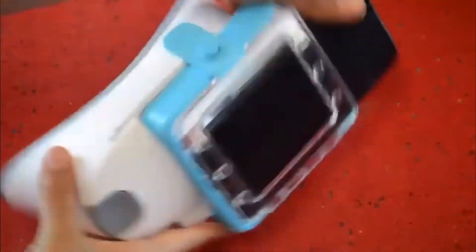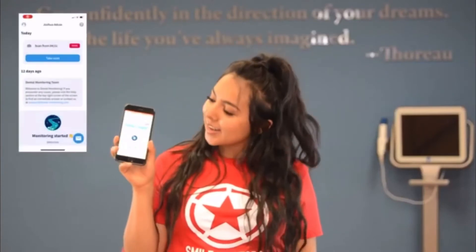Now you are all set to take your scan. Next, you'll open up your Smile Doctors app and hit the blue take scan button. Follow the prompts in the app. We'll show you now and then let you try.